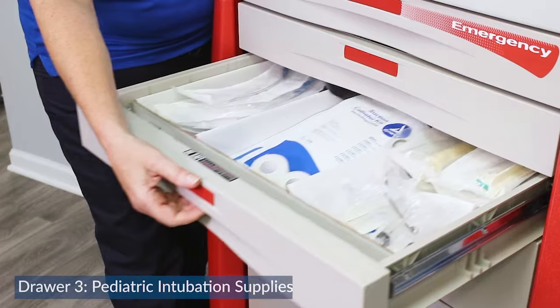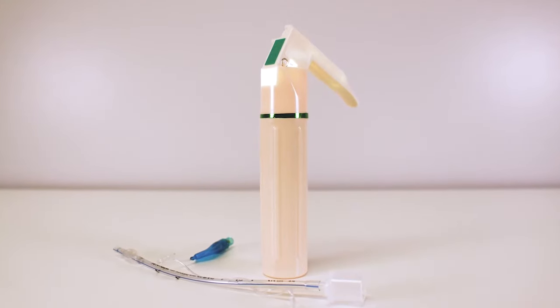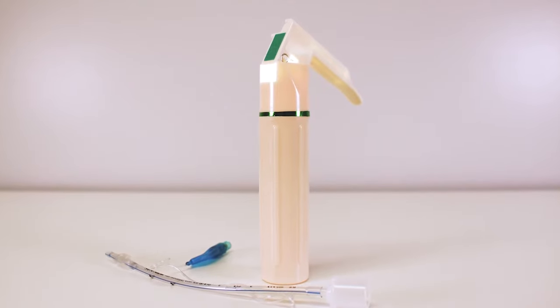The third drawer contains all of our pediatric airway and intubation supplies. It contains the same items as the adult drawer but in smaller sizes.